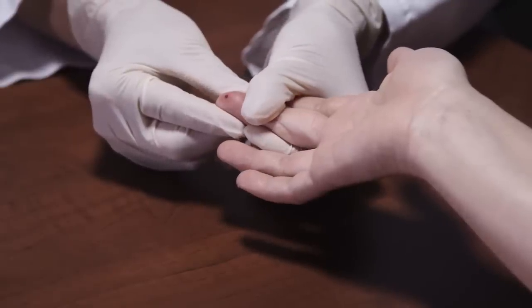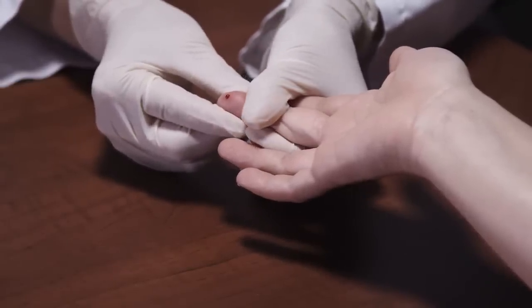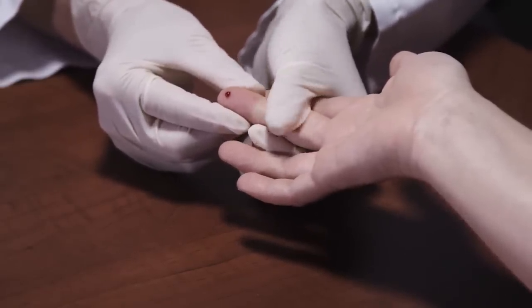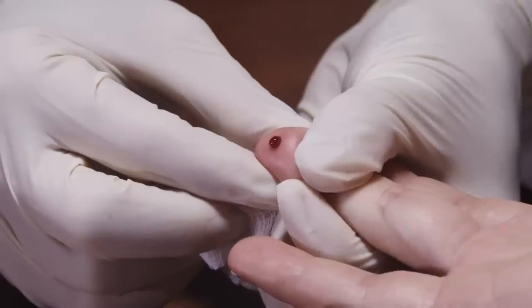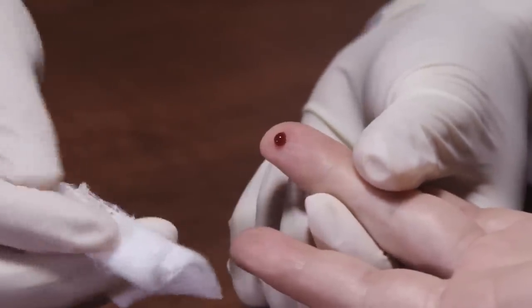To obtain a sufficient blood drop, gently squeeze and massage the finger in a one-second interval until a full drop forms. Do not excessively squeeze the finger.